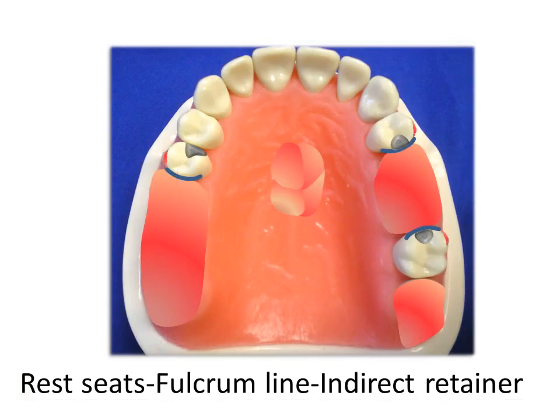The abutment teeth in this example are examined on the articulator. We prefer that areas of rest preparation are not located in areas of habitual occlusion. We locate the rest seats as indicated in the diagram. These locations are easily accessible and may be conservatively prepared. The marginal ridge reduction is 1.5 mm. These rest seats are spoon-shaped with the deepest portion about 2 mm. Forming the rest seat in this way will direct forces down the long axis of the abutment tooth. It is important to avoid preparations that act as inclined planes.